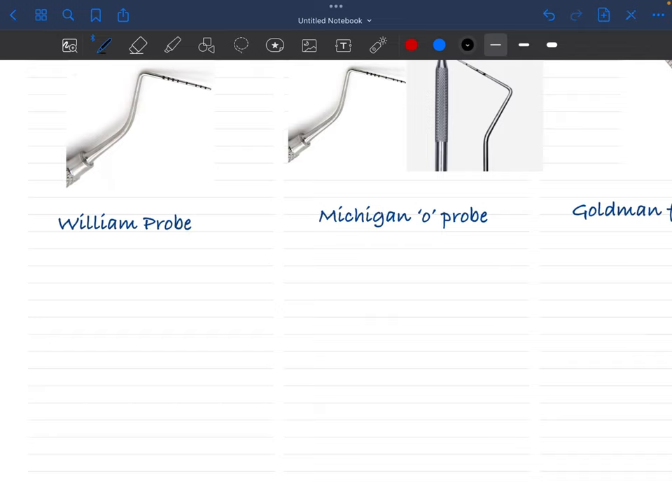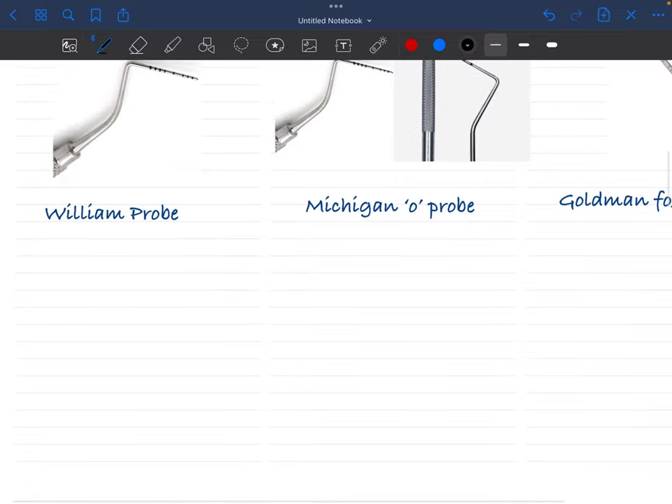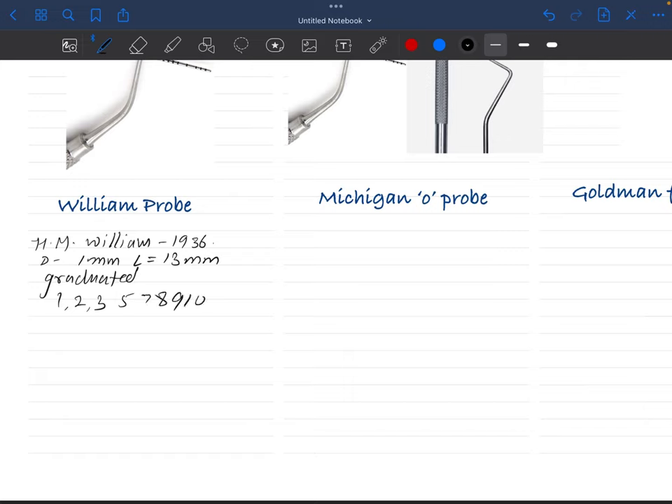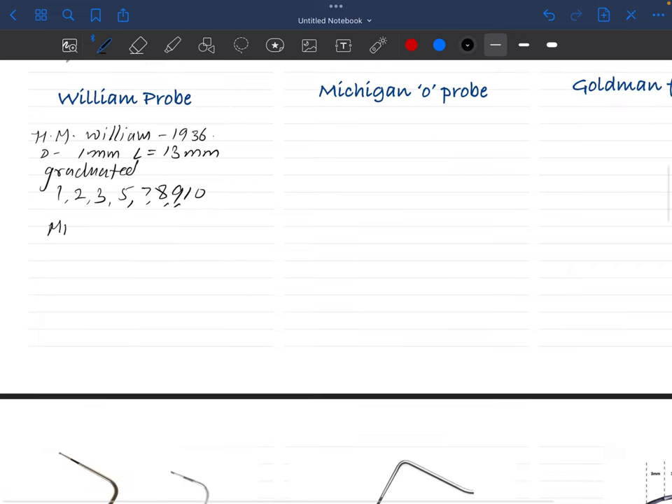Now we will discuss the Williams probe. It was introduced by Williams in 1936. It has a diameter of 1 mm and a length of 13 mm. It is a graduated probe. The markings are 1, 2, 3 — 4 is missing — 5, 6 is missing — 7, 8, 9, 10.